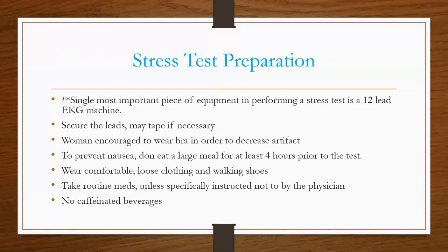To prevent nausea, don't eat a large meal for at least 4 hours prior to the test. Wear comfortable, loose-fitting clothing and walking shoes. Take routine meds unless specified by the physician. And don't drink any caffeinated drinks. That includes coffee, you guys.